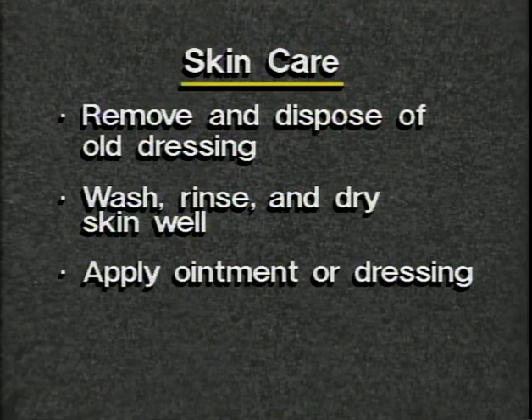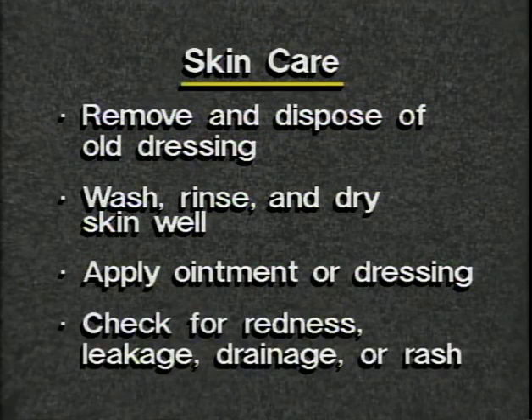The physician may have prescribed an ointment to be applied on the skin around the tube or a dressing to protect the site. Your nursing supervisor will demonstrate the application of the ointment and dressing. Check for any redness, leakage, or drainage around the stoma, or any rash or pimples on the abdomen. Document and report any problems to the nurse.